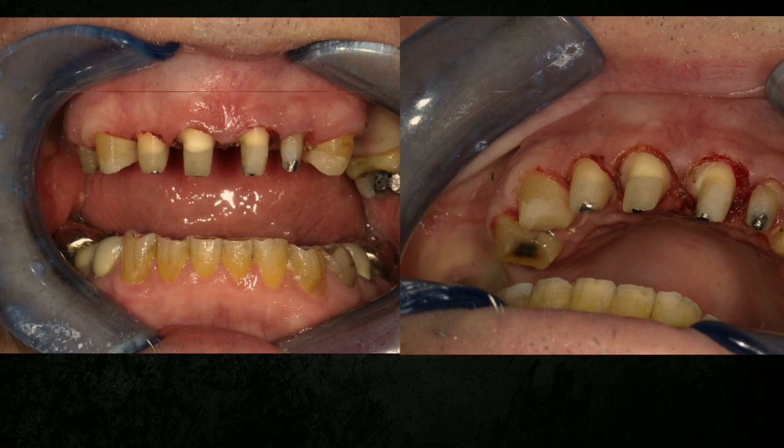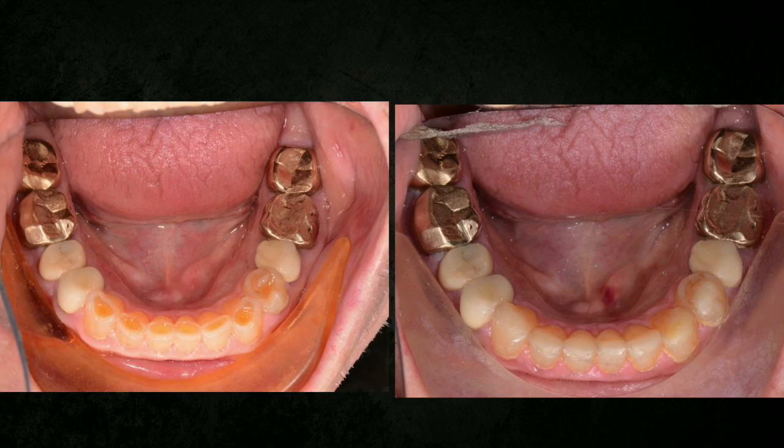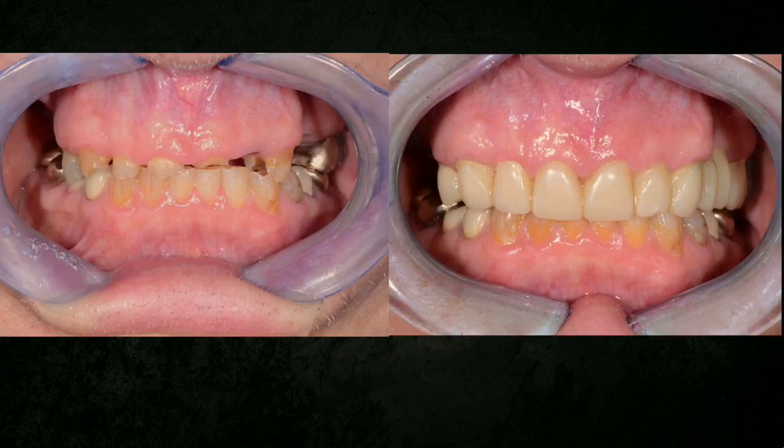So our plan was to do some bonding across the lowers. We haven't done that yet. And then crown lengthening, endo and post and cores across the front. Plan był taki, że na dole odbudujemy z kompozytu zęby, to jeszcze nie zostało zrobione, natomiast na górze leczenie kanałowe, wkłady koronowo-korzeniowe albo wkłady i odbudowa pracami protetycznymi. Lower bonding's complete and we maintained his lower crowns in the posterior. Zachowaliśmy po odbudowie zęby przednie na dole i zachowaliśmy jego korony w odcinku bocznym.